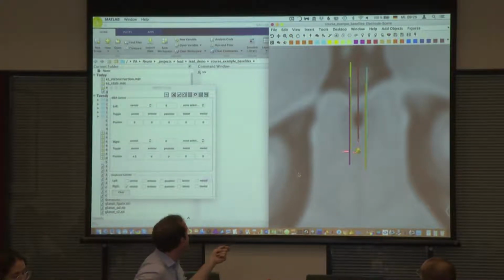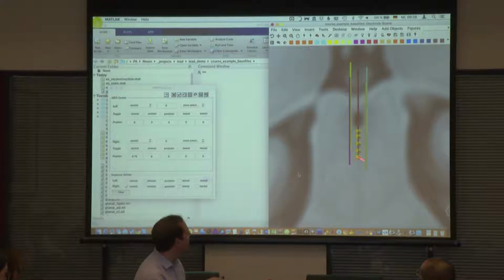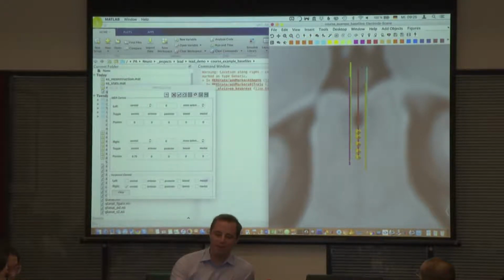So this way we could go, usually in Berlin at least, we often start 7 millimeters before target. Then we could say maybe there was an STN cell, another one, and another one, and then stop. And then we have some space marks here. And what I did is press space for these yellow bubbles, but there are also some more commands. So I know that there's T for top, I think, and B.